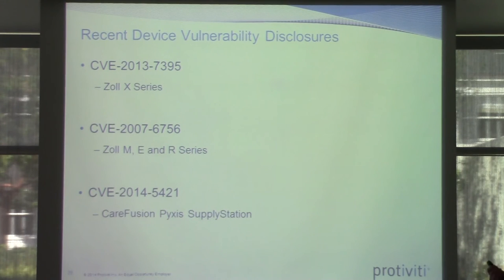Documentation that's still on their website hasn't been updated and still has it. So, the supply station vulnerabilities were in there. Those were, you know, hard-coded passwords inside of the database. They also run remote services that have used the same credentials as the SA accounts for the database, so you can remote into these systems.